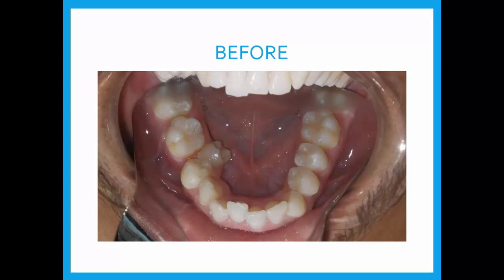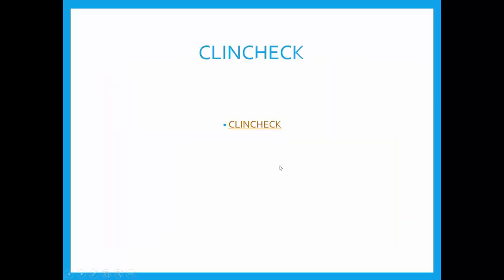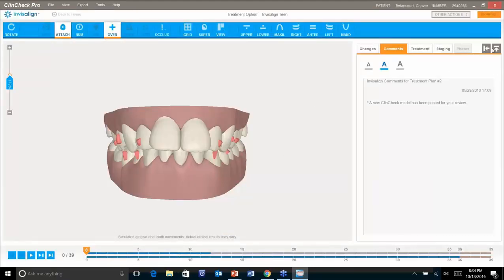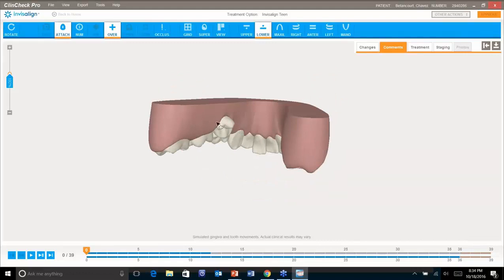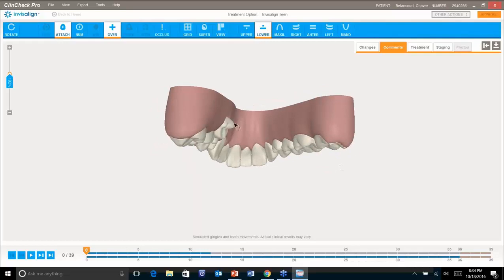In order to build an aligner around tooth 29, I just need a good impression. If you can impression the lingual surface — the most important part is to capture underneath that tooth for the aligner to lift it in. I need an impression of that to make a ClinCheck showing that whole tooth. If it's in the ClinCheck, the aligner will be built around it. The final step is just teaching the patient how to put it on. So there it is — we got to get underneath it. The impression got in there and got the border of the tissue, giving me the full lingual surface in my ClinCheck, which is the most important part to carry it into the arch.